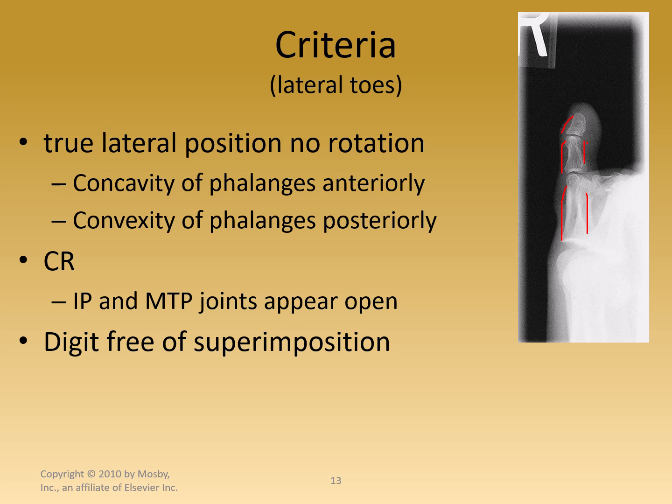The body part needs to be placed parallel to the IR so that the interphalangeal joints will be perpendicular to the IR. Therefore, we can use a perpendicular central ray to go straight through those joint spaces and project them open on our image, which we see here. They're very nice and open, these joint spaces. Even the metatarsophalangeal joint, all right?